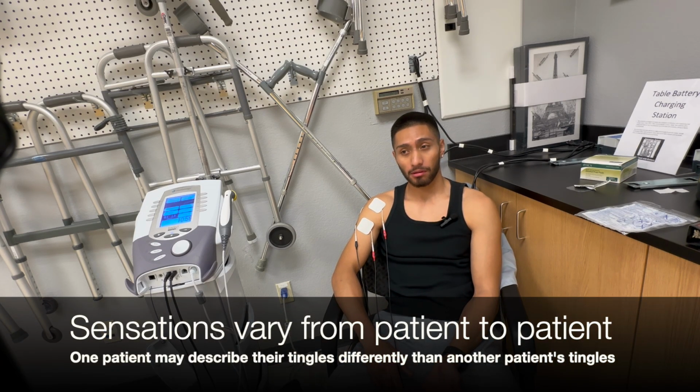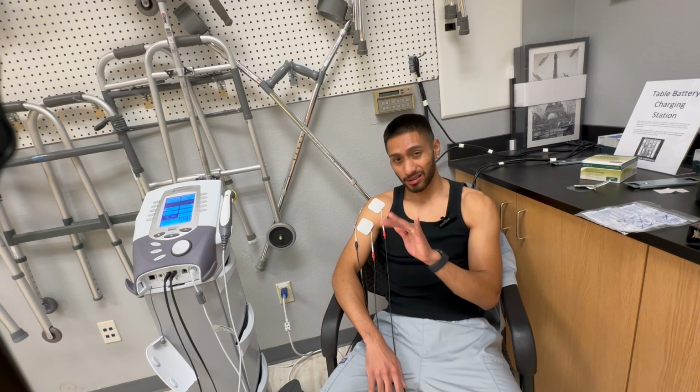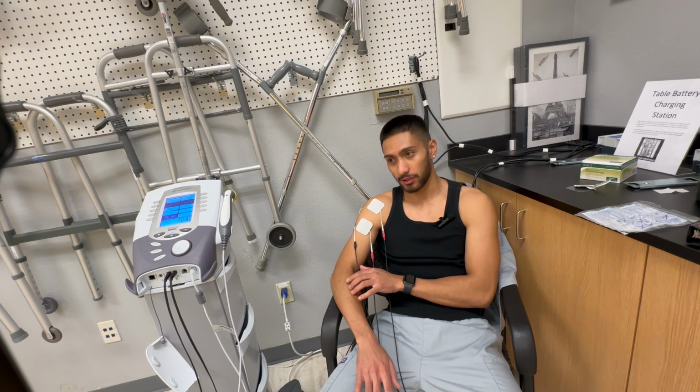It's very dependent on the patient's response. To describe my tingling sensation, it's almost like tickles or taps, but the muscles aren't moving. It's just very, very light taps going on for my tingling sensation.